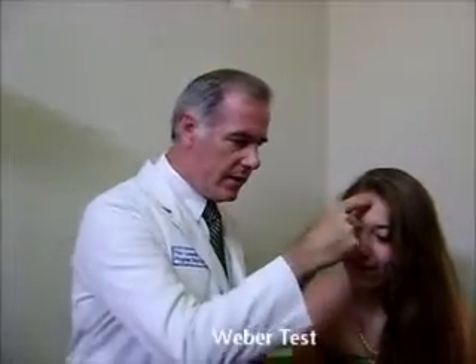Let's talk about the Weber test. The Weber test — you ask the patient if they hear it here, here, or here, and you strike your tuning fork and place it on the top of their head.